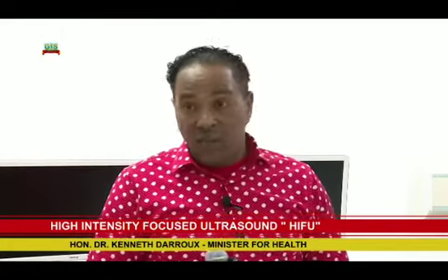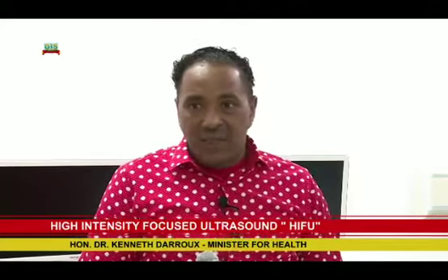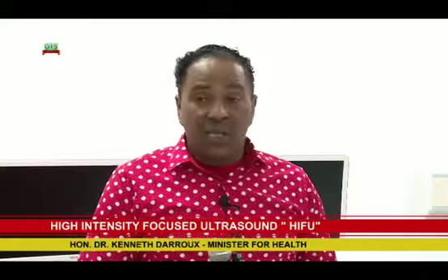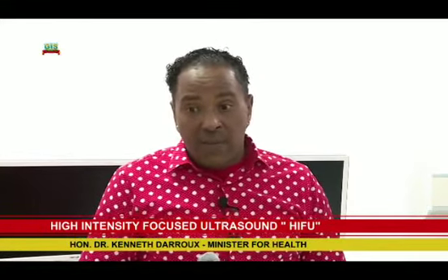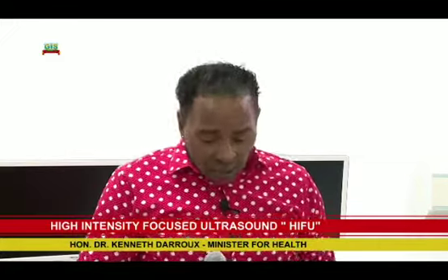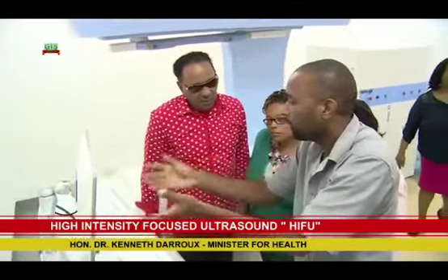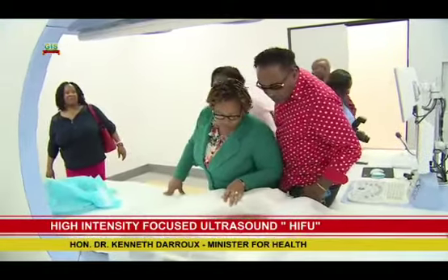It has been proven particularly useful in the treatment of prostate cancer. But in recent months, in recent years, it has also been used in treatment of kidney, liver, among many others. In fact, they're now exploring its use in brain tumors and other cardiovascular lesions, circulatory issues, etc. To dispel the myth that it is a cosmetic tool: yes, this technology has been used over the years in anti-aging and anti-wrinkling procedures, etc.